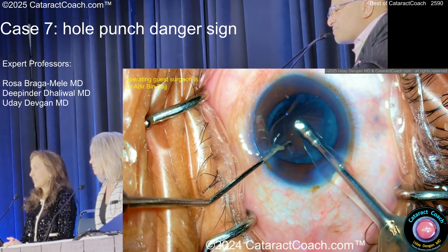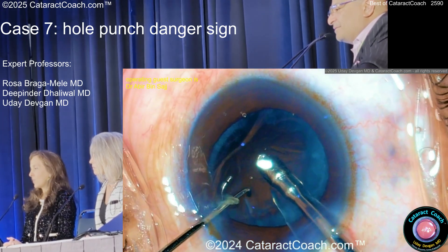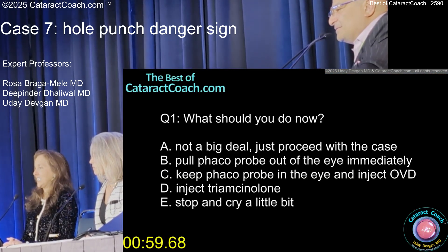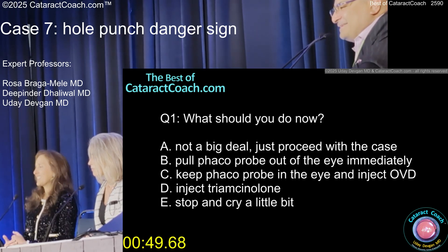So far so good — and there we go. Now a little bit of vacuum there, and we go right there. So now what do you want to do? Not a big deal — just proceed with the case. Pull the probe out of the eye immediately? Keep the probe in the eye and inject OVD? Inject triamcinolone? Stop and cry a little bit?